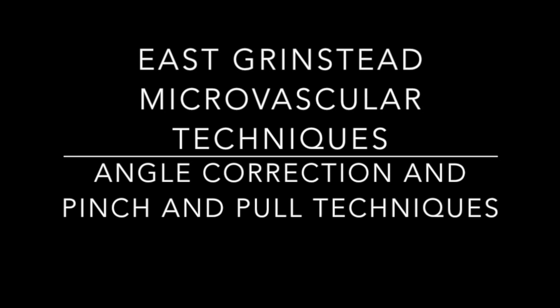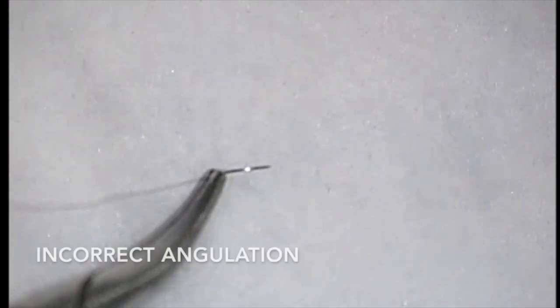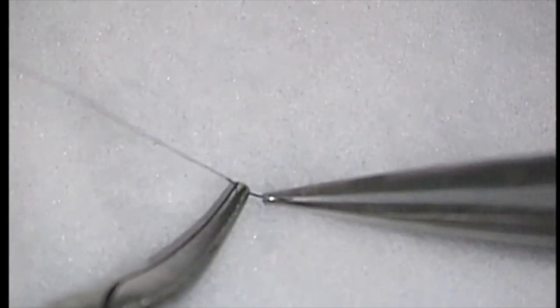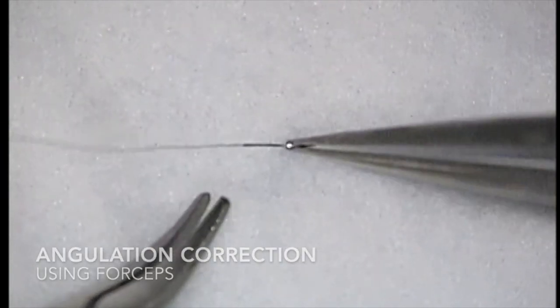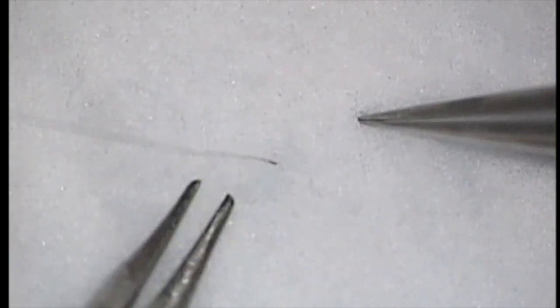Also, what I found equally important and quite supportive was the moment when you showed me how to rotate the needle on the needle holder in an effort to minimize the difficulty in passing the needle and changing the needle direction.